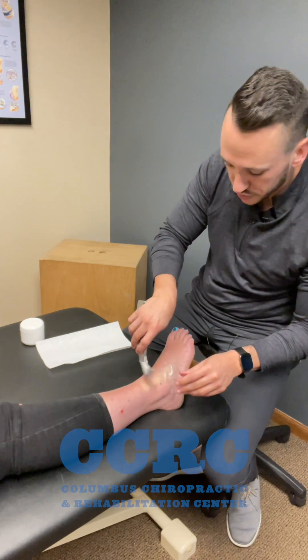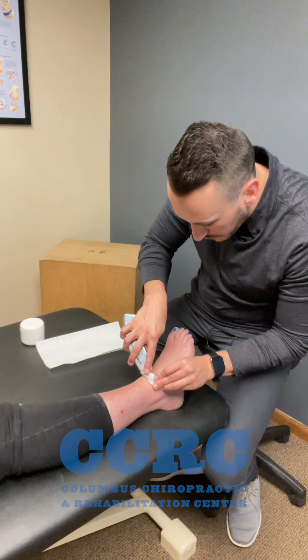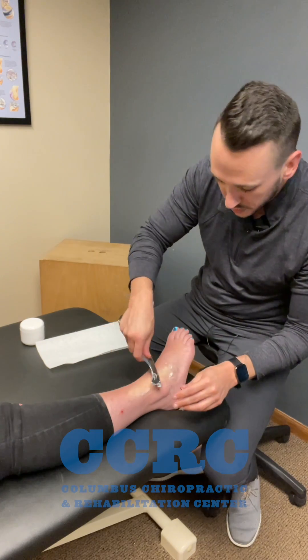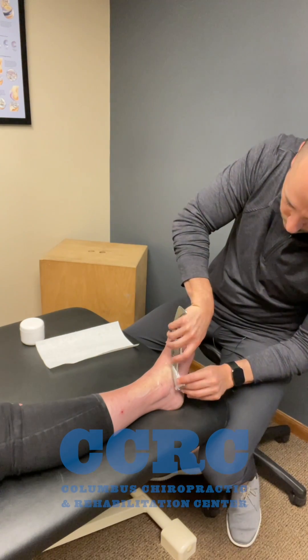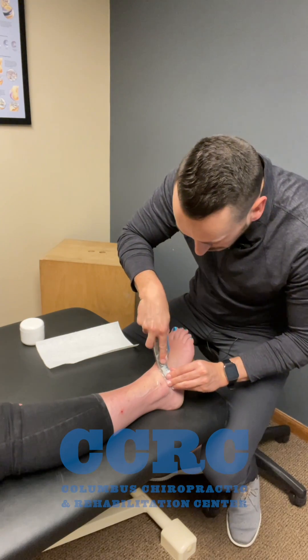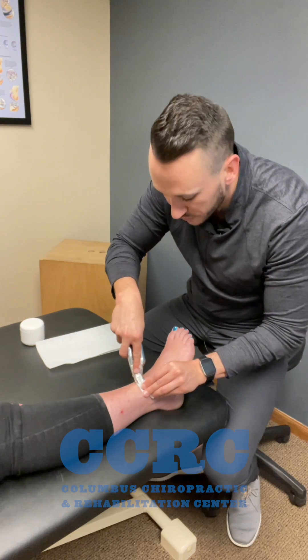Now that I've done a couple of strokes, I can begin to add a little bit more pressure to really move that inflammation up and out, and I finish all the way up — working my way around that malleolus, the bone on the outside of your ankle, pushing the fluid up and out.